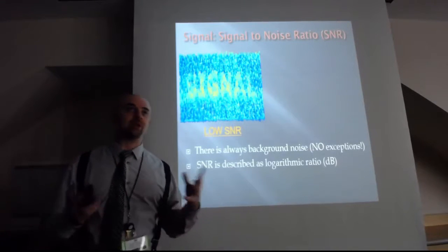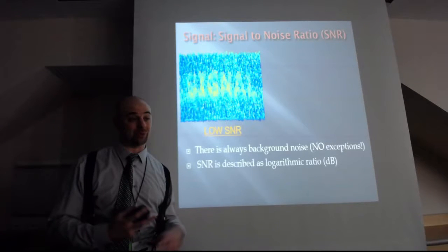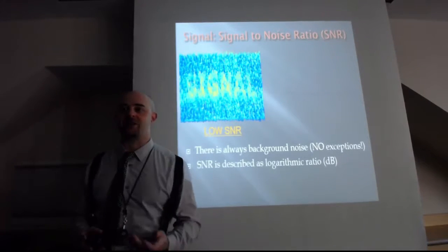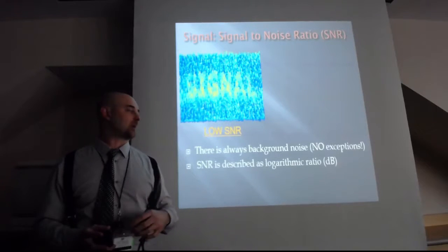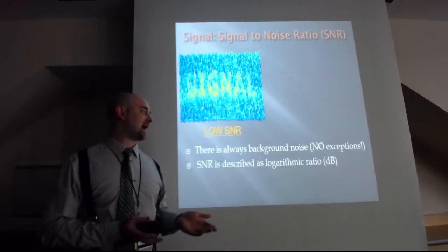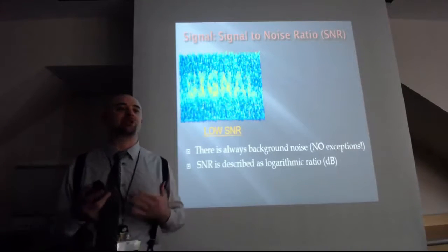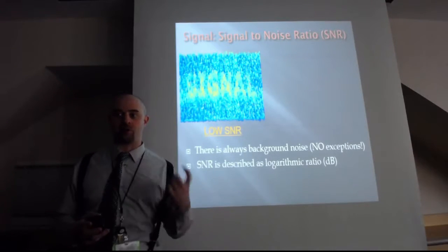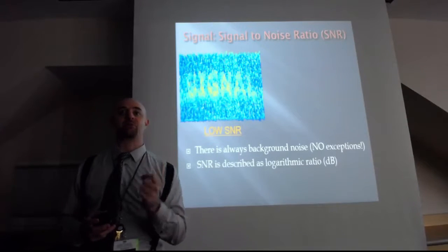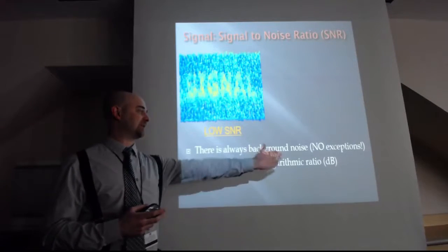Now, what does that mean? Well, the fact that signal to noise is measured in a logarithmic ratio means that by definition, it will be measured in decibels. That might sound confusing because you're used to hearing decibels as an audio thing. Well, decibels is not a dedicated unit for audio sound levels. The point to be taken away here is people describe human perception of auditory stimuli in terms of that signal and how it's presented relative to background noise, as in literal phonic noise in the atmosphere, and that's why it's measured in decibels.